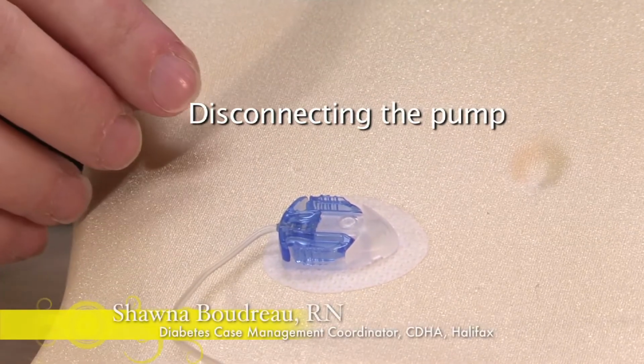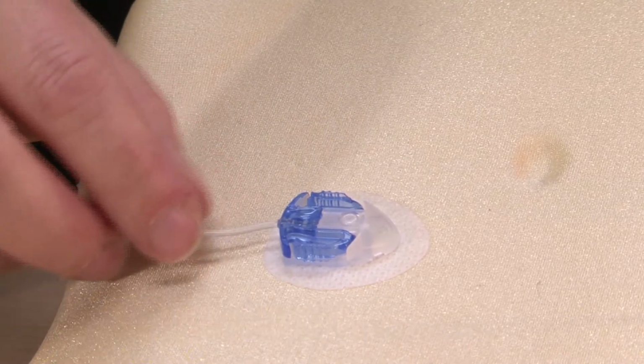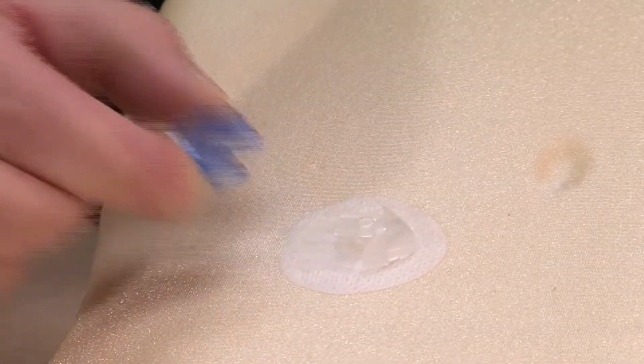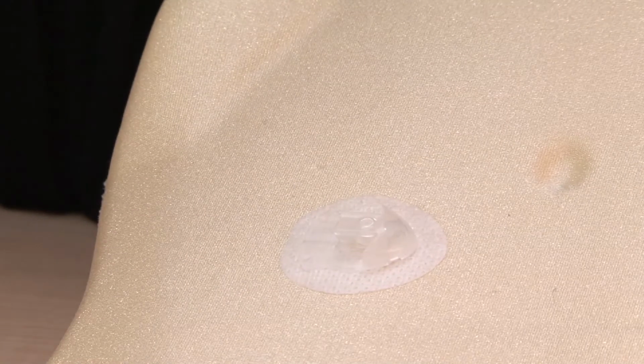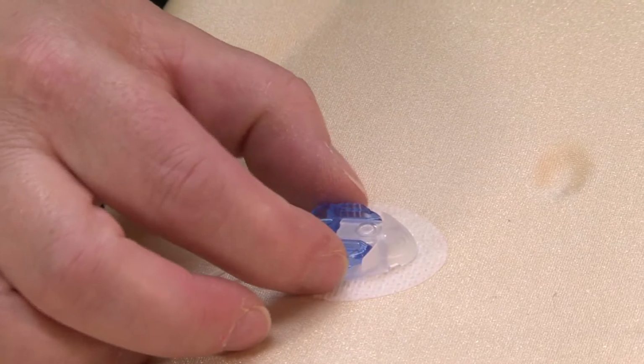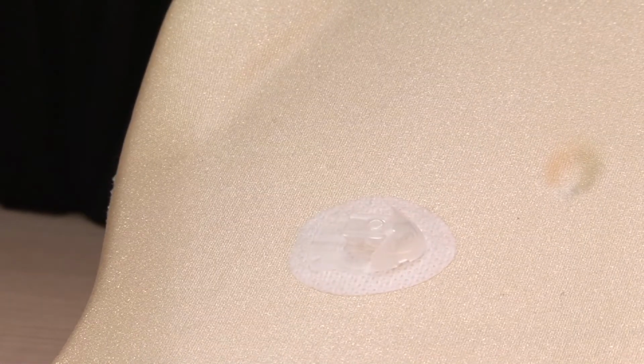With the pumps that have tubing, the Animas, the Medtronic, or the Accu-Chek Spirit, there's kind of two main infusion sets that are attached to the patient. One looks almost like a buckle, and you're just going to squeeze and pull that out. So I'll just show you that again. It's in. You're just going to squeeze. It's kind of ribbed. You're just going to pull that out. Then the patient is detached.